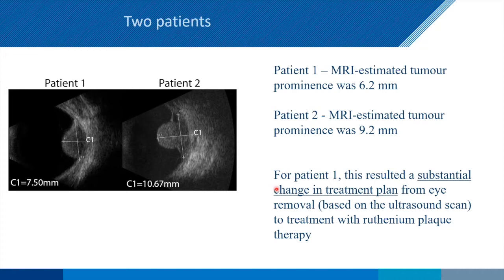So we've got the 7 Tesla, and then maybe 10 years ago, a colleague of mine came up when I was working at Penn State, and he's a neurosurgeon, Steve Schiff, who's known to some of you. Essentially he's a pediatric neurosurgeon treating kids in Uganda, and he said it would be fantastic if we could get an MR system that was cheap and portable, and I could use for pediatric hydrocephalus. Is it possible?